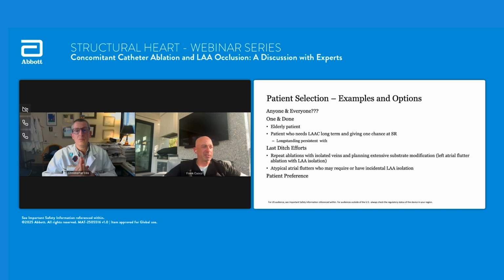He also did not want to be on long-term anticoagulation. He had a lot of nuisance bruising and bleeding. Again, another patient that I said, okay, if we're going to bring you back, this is your third ablation. You're not really having AF. You're only having atypical flutter. I think this is reasonable. We can manage this, but we're probably going to wind up with isolation of your appendage at this time.